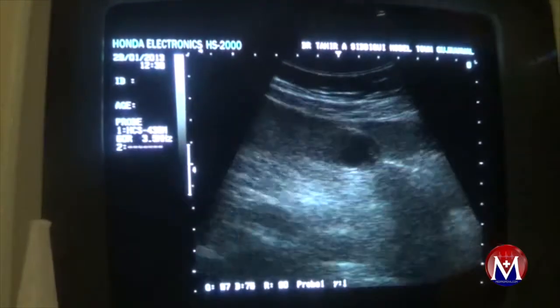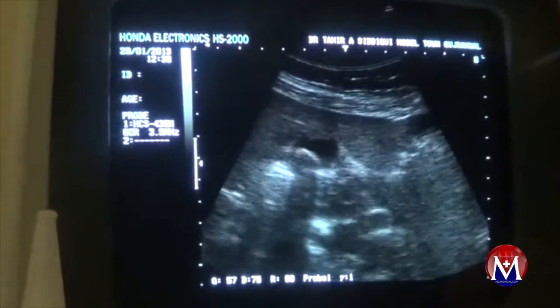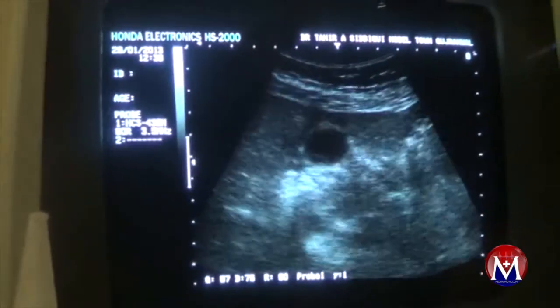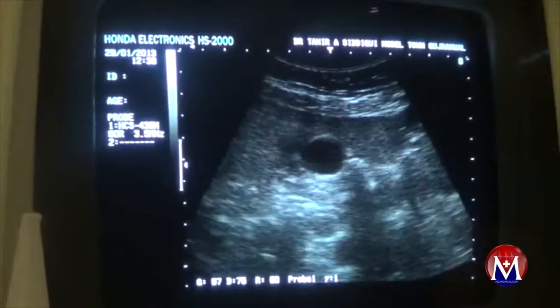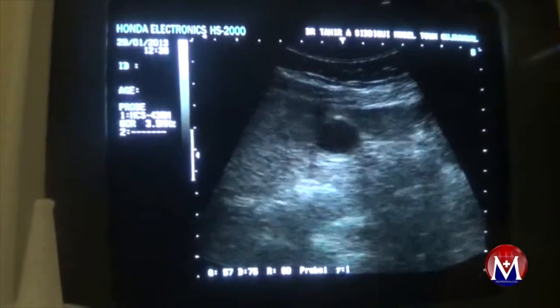This is the transverse section. The wall of the gallbladder is not thick — it is normal.